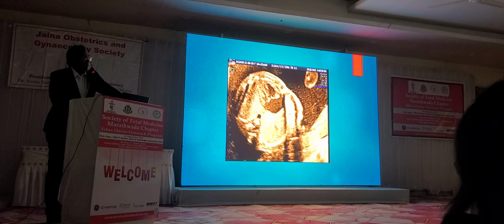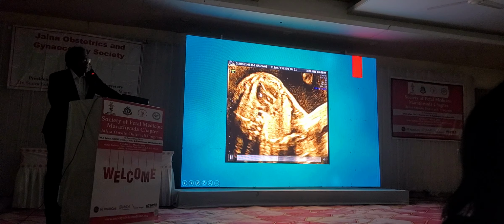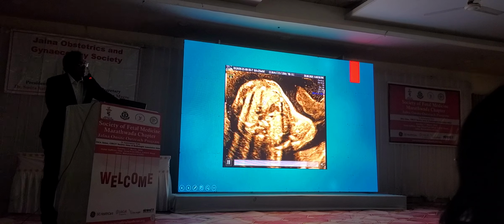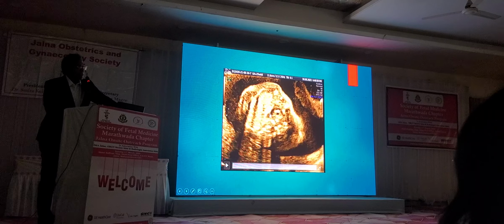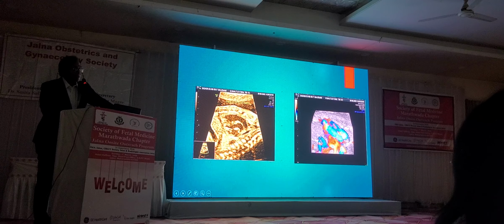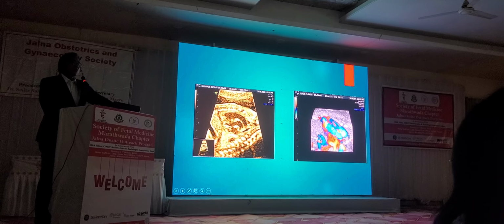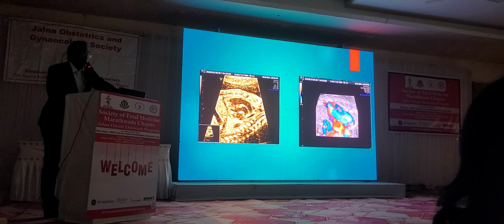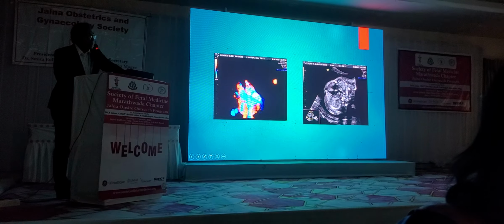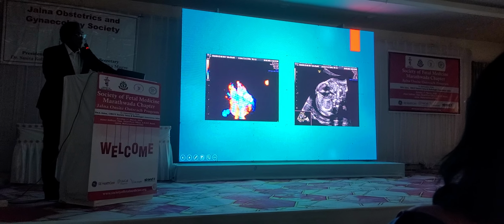In the four-chamber view, that is the left ventricle, and the vessel that is arising from the left ventricle is branching. So that was a case of parallel vessels. You can see this is a glass body image. As I told, once you find an abnormality, you have to go beyond the protocols. So this was glass body just to reaffirm. This was a 3D of the Doppler.